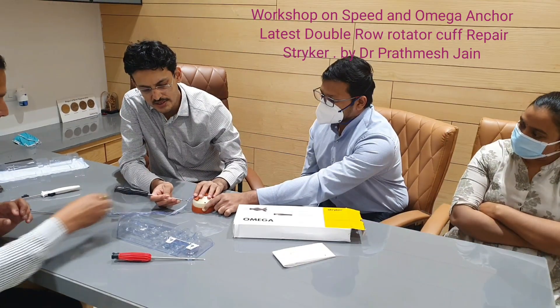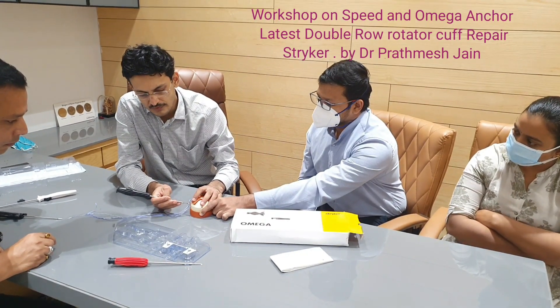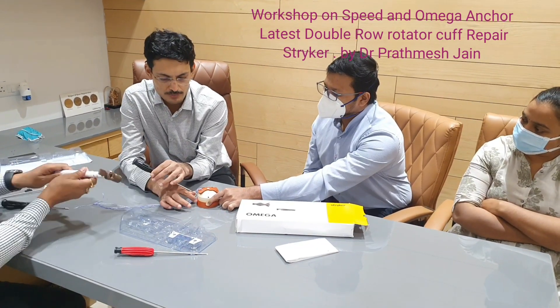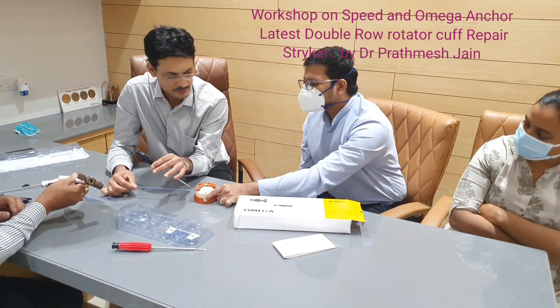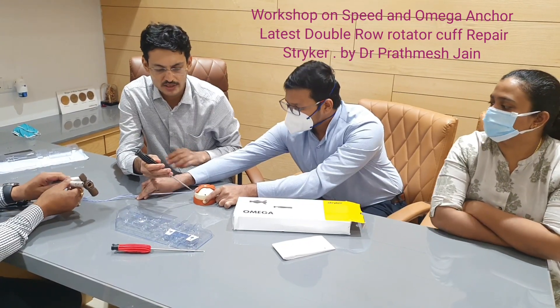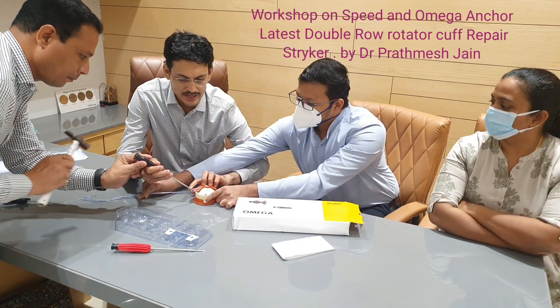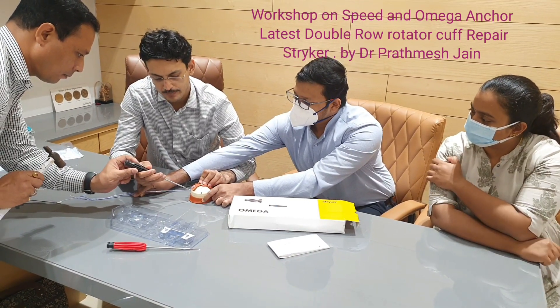When you want to insert it on the lateral row, put a little tension on the tapes. This is a self-punching anchor — again, you don't need any separate insertor. Put a little bit of tension on the tapes you are inserting and then punch it to the blackish line, which indicates how deep you want the anchor inserted.